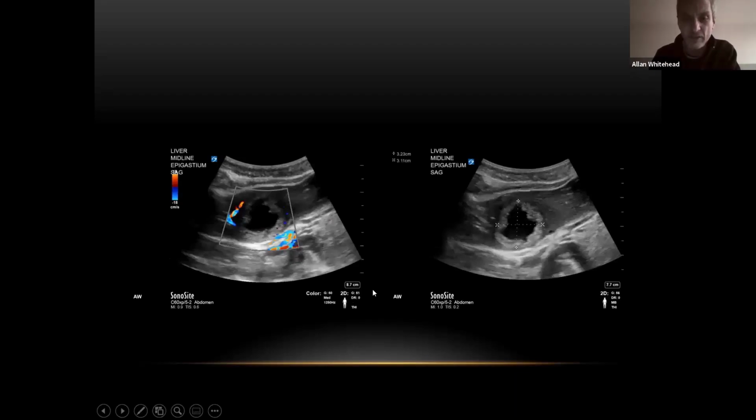And I measured it, and you can see it actually had this sort of funny appearance, almost like a sort of edema around a tumor, that you get in the brain with that sort of ring enhancing lesion. And wow, it's clearly broken down in the center of this lesion in the liver. So I think this fluid is that classic necrotic tumor where the tumor tissue has broken down and become fluid, and it's got edema around it, and obviously a little bit angry in that area.